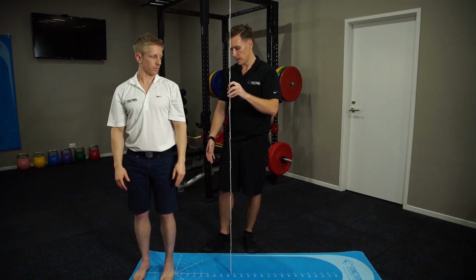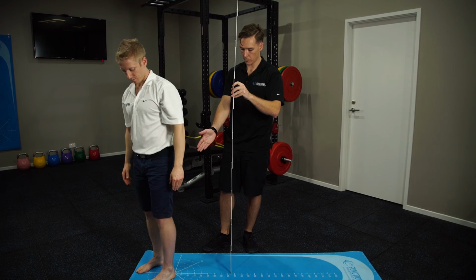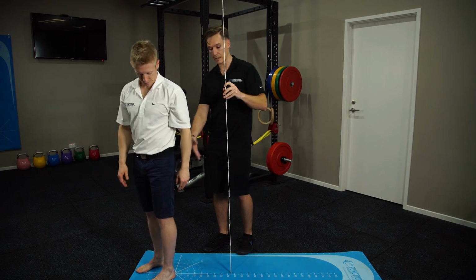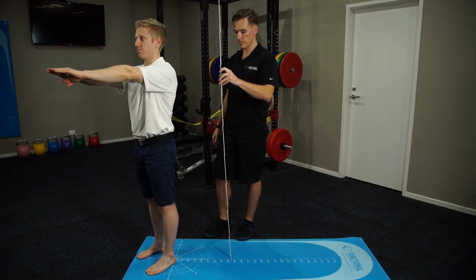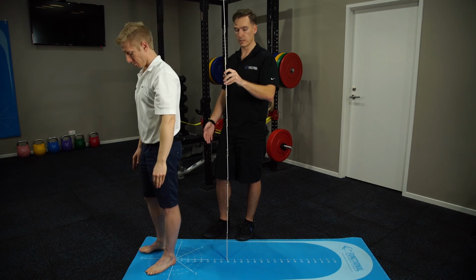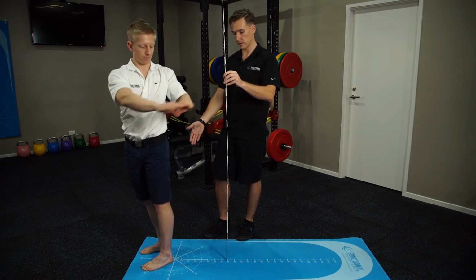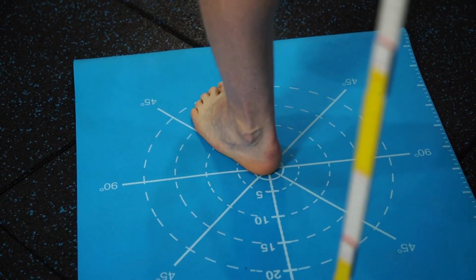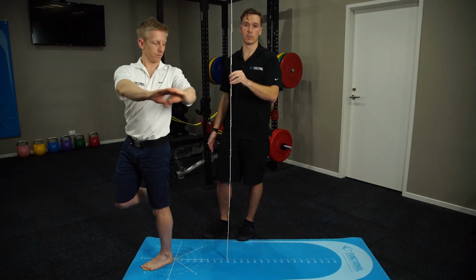So if we get Stephen now to stand so he's facing slightly further around, we can measure our angulation on the mat star. We'll then get Stephen to stand with both hands out in front, and we'll get him to rotate toward the measurement line. Once again, we can decrease the stability by going into either a single leg balance in toe touch or a full single leg balance stance to check what happens in his movement through his spine.